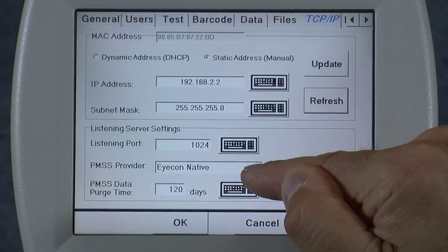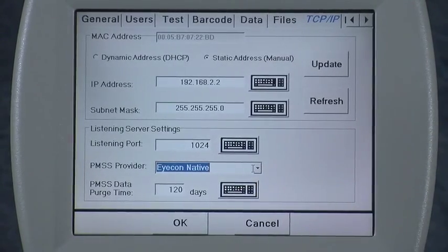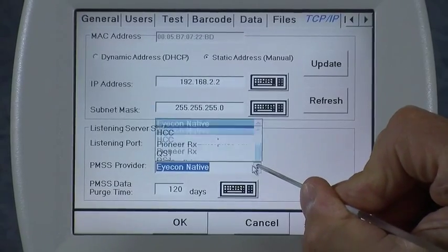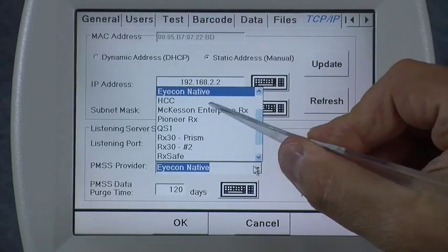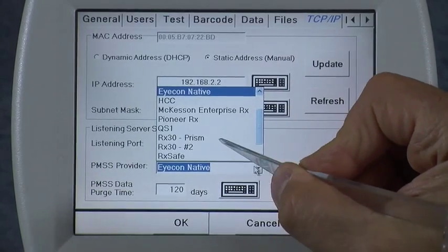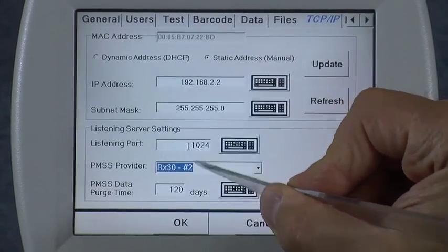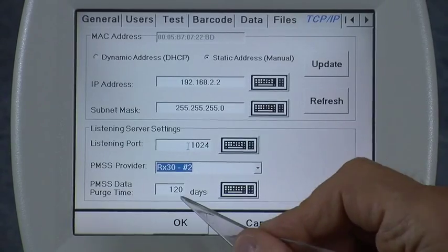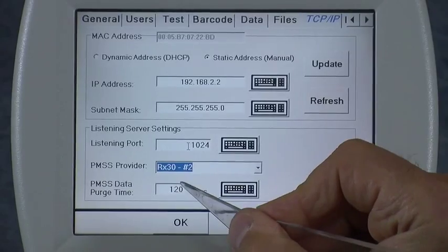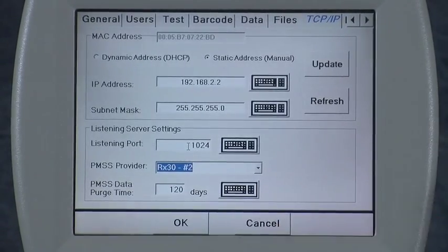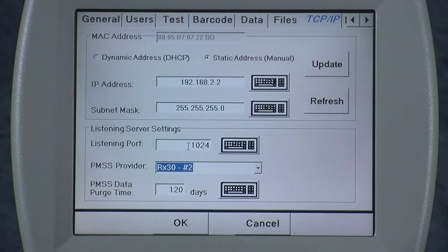Next is the drop-down menu that shows all of the available interfaces that the icon supports. New ones are continually being added, so look on the list for the one you're interested in and select it. Below that is the PMSS data purge time — this is how long the icon holds on to data sent over from the system. Typically you want to set this for a fairly long time, as it determines how long the icon will keep track of your partial fills.